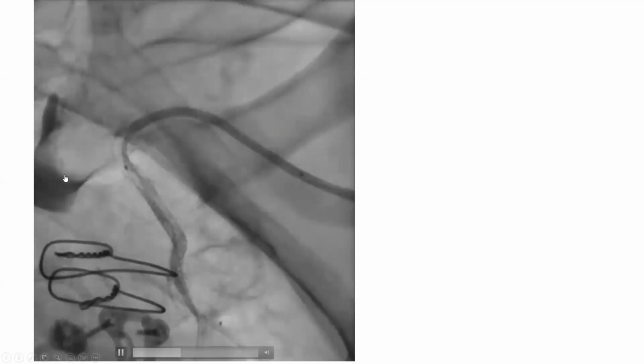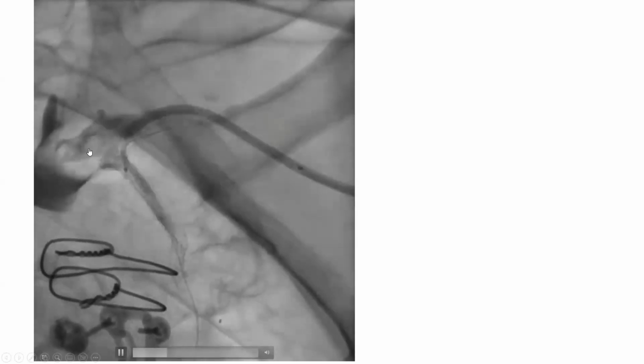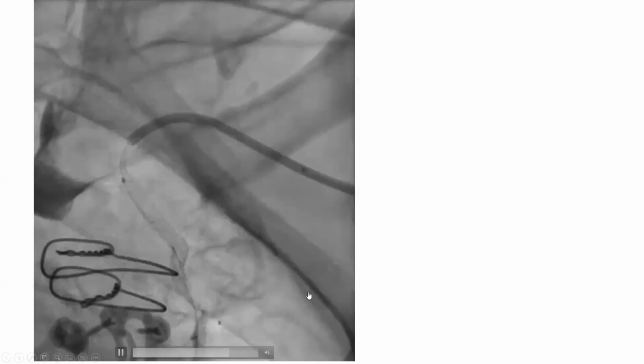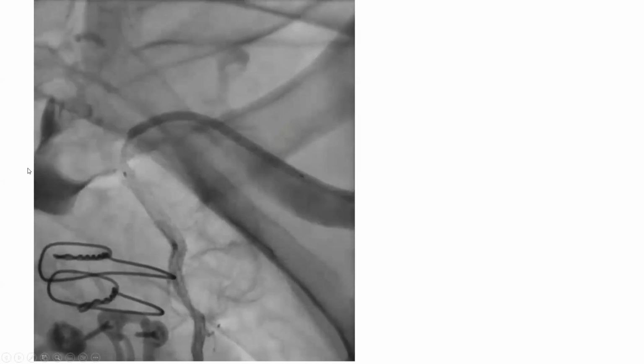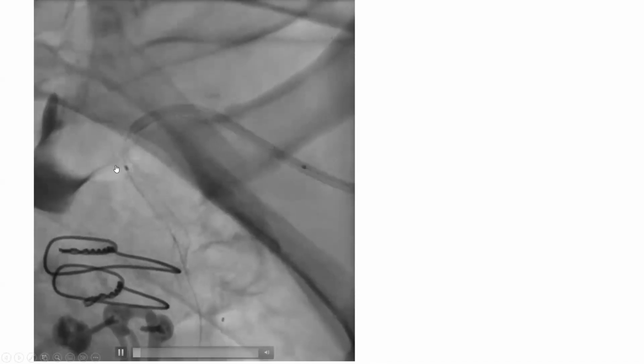It's just not expanding anymore, and it will be collapsing progressively with time. There is no longer any active dye spilling into that hematoma. This hematoma will heal gradually over time, over the subsequent few weeks. So keep it simple. Just take care of the entry site and the rest will heal on its own.